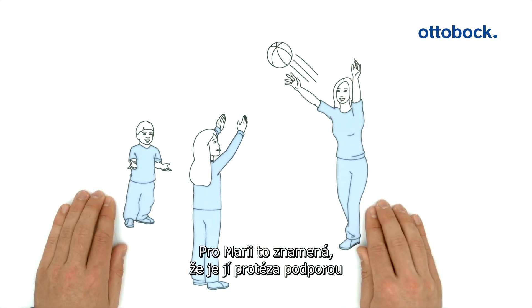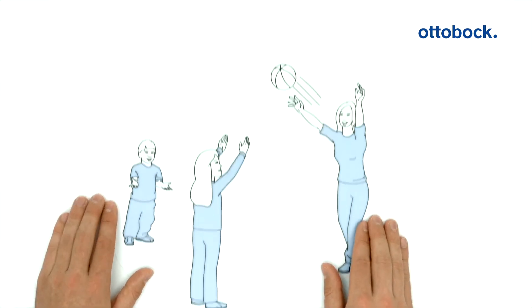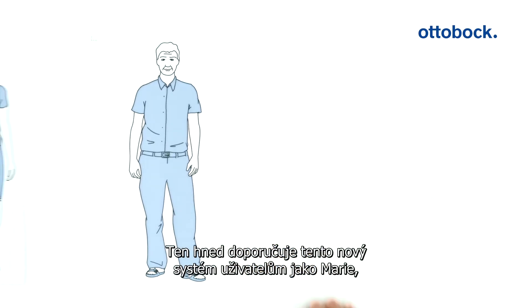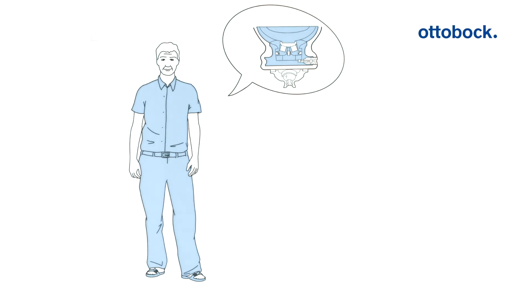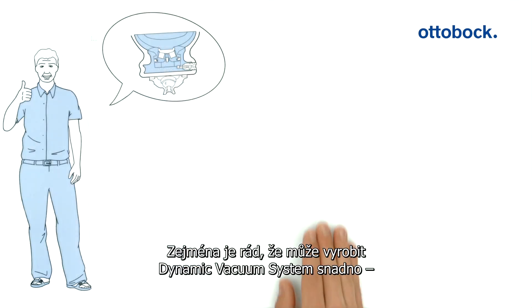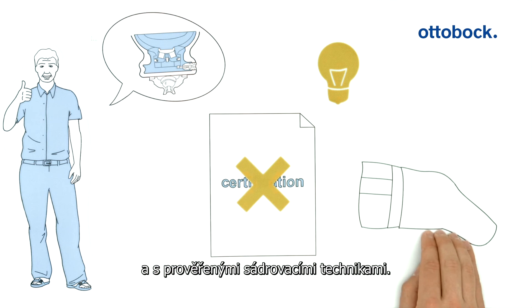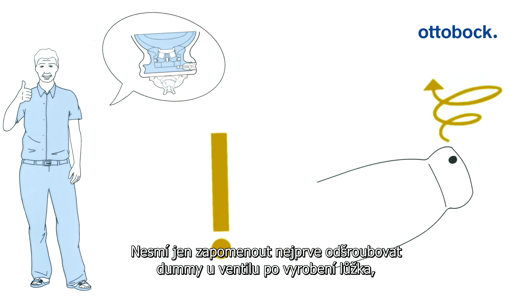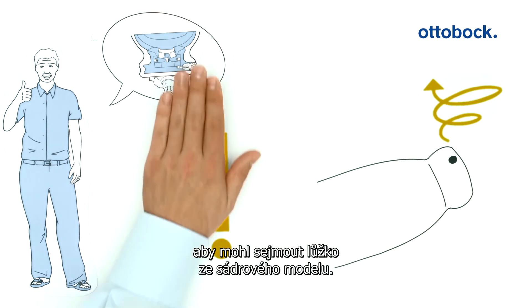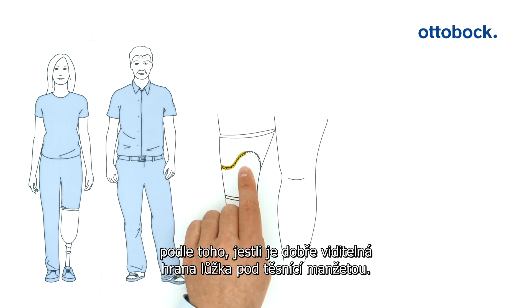For Maria, that means that her prosthesis supports her especially when playing with her children in day-to-day life. And for Peter, he can recommend the new system to users like Maria immediately for custom vacuum adjustment. He is especially glad that he can produce the dynamic vacuum system easily without the need for certification and with well-known plaster casting techniques. He just needs to be sure to first unscrew the valve dummy after producing the socket in order to remove the socket from the plaster model. He can see whether everything functions correctly based on whether the socket trim line is showing under the sealing sleeve during stance phase.